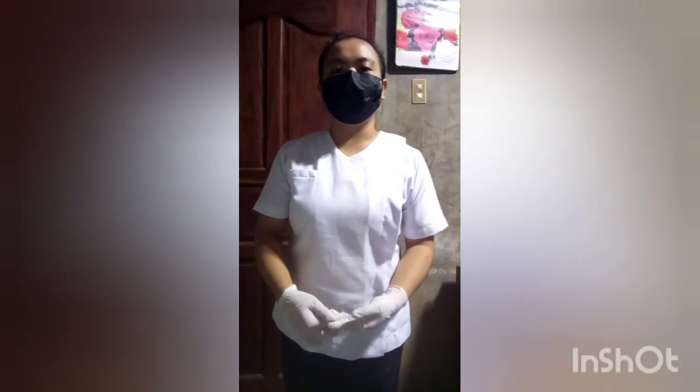For our third procedure, perform hand hygiene and put on PPE if indicated. After washing our hands, we need to put on PPE. We have here gloves. Then put on mask. Then the next procedure is to identify the patient.